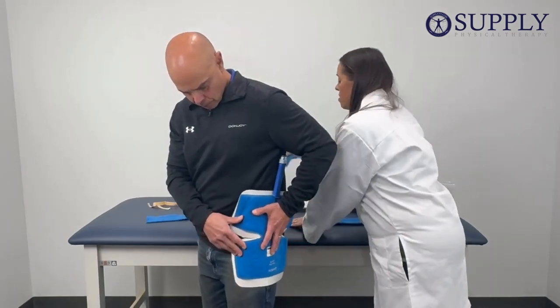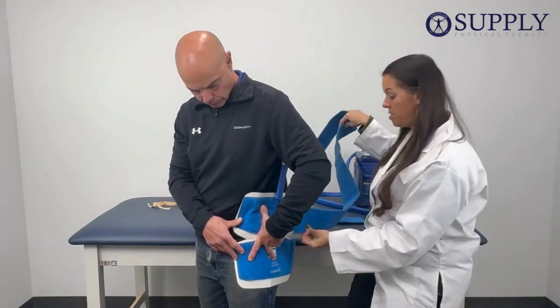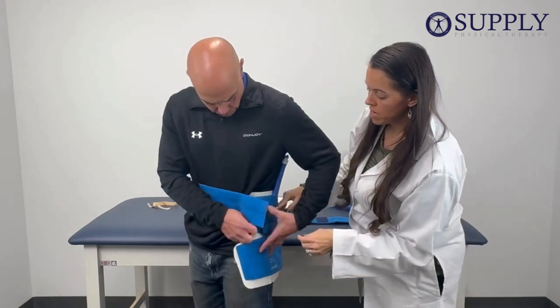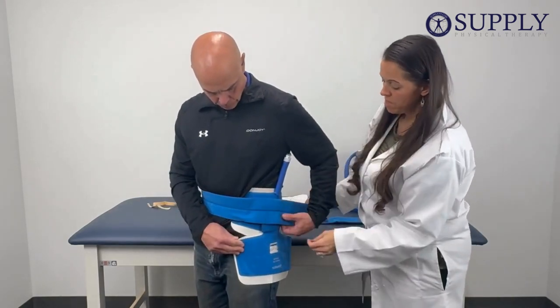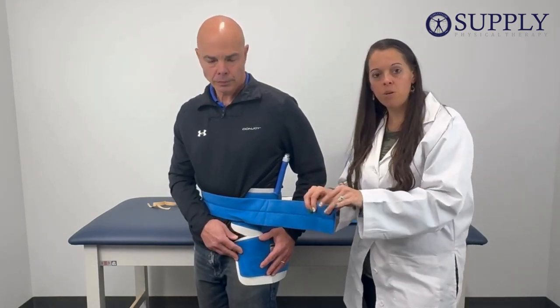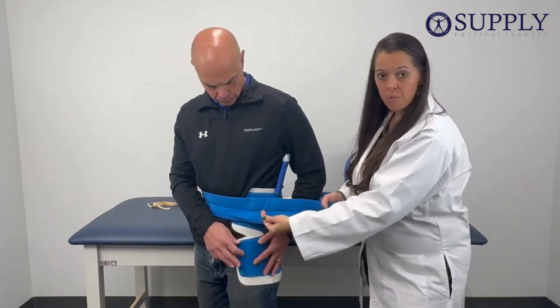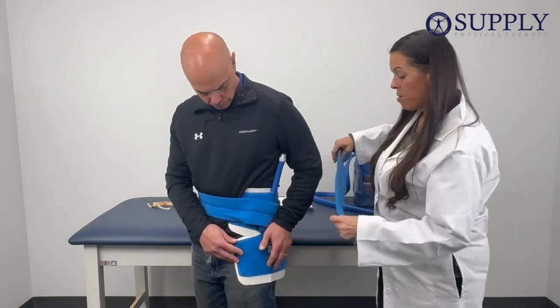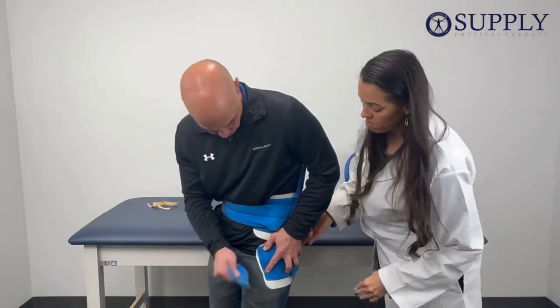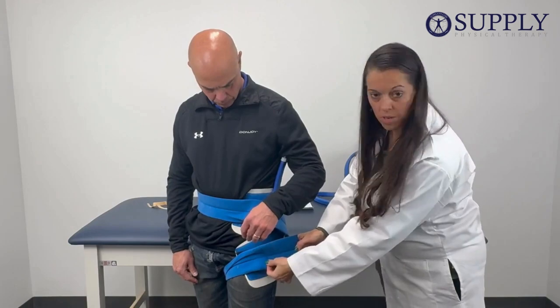We're going to put on the long strap first, which is the one that goes around your waist. We're going to attach it here, bring it all the way around, and attach it in the front. The straps are designed for different body types, so if you're smaller or larger, it's made to go around you. If it's a little bit too long, you can always feel free to cut it. After we apply that one, we're going to apply the one that goes around his thigh, bring it around, and attach it. The same applies to this one as well — if it's a little bit too long for you, you can just trim it.